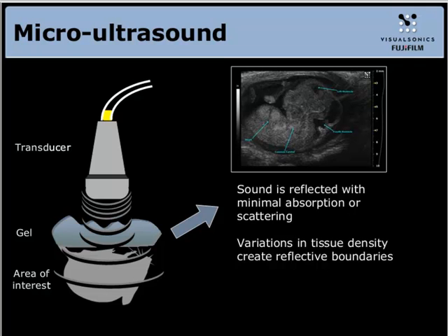So again, we're looking at a developing mouse embryo in utero here, and we can see some structures such as the developing heart. We can actually see a ventricle in the brain, the nose, other fine structures. So again, the scale here is on the order of 30 microns. It just gives you a sense of how we can visualize in vivo many of these structures within the living organism.